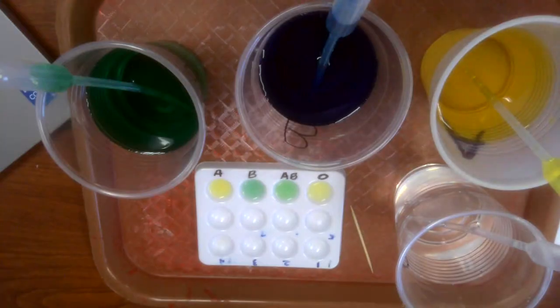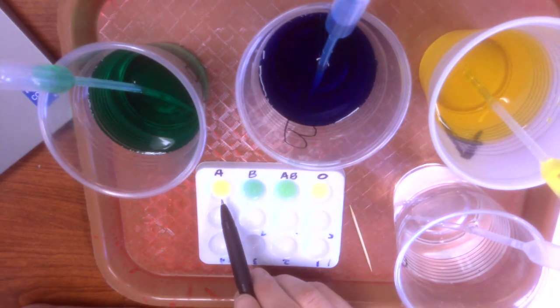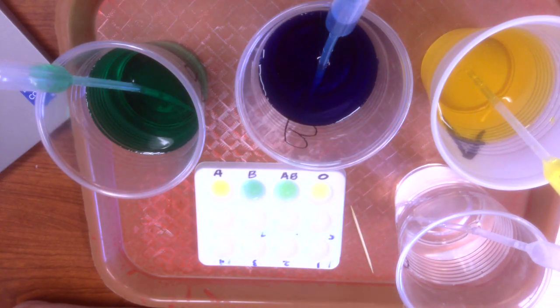All right, so if I were to determine this and I were to say, okay, A went from yellow to a little bit of a darker yellow, okay, that is going to be safe. My blue definitely changed from blue to more green, okay, so that is unsafe. My green stayed green, even though it kind of became a different shade of green. That is safe. And then my clear turned yellow, so that is unsafe.